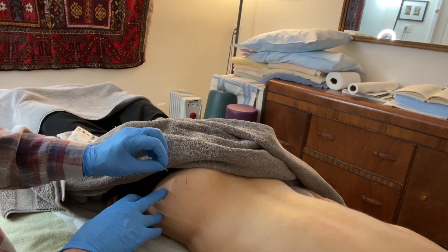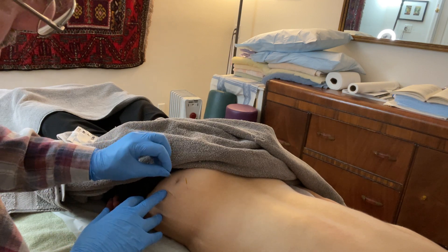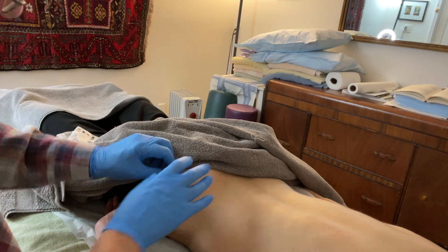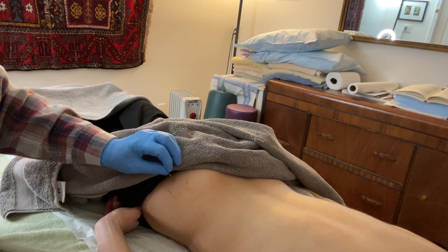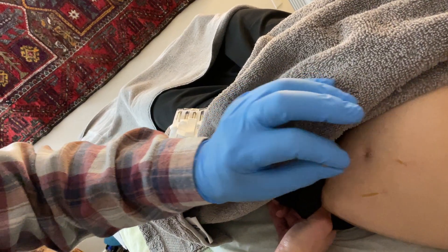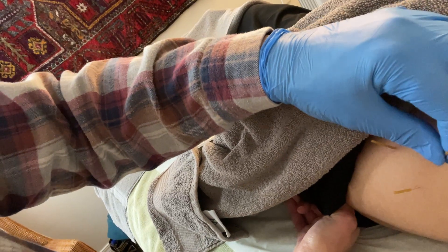I've already gotten the needles in, and I've already gotten a really big release with this pistoning technique, so I might not get more of a release. I'm going to bring the camera a little closer so you can see. That's the pistoning technique. PTs call it pistoning technique; in acupuncture and Chinese medicine, we call it lifting and thrusting. It's the same technique.